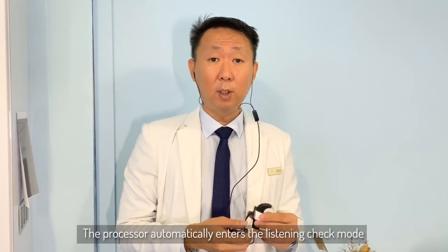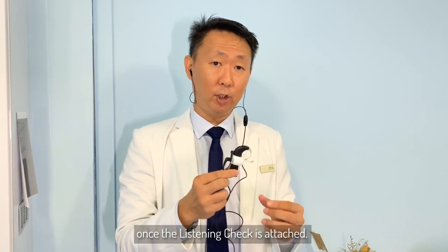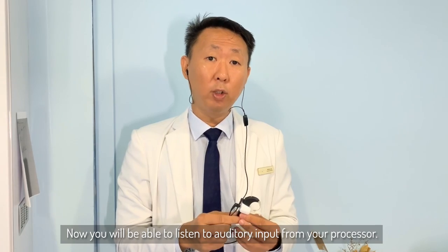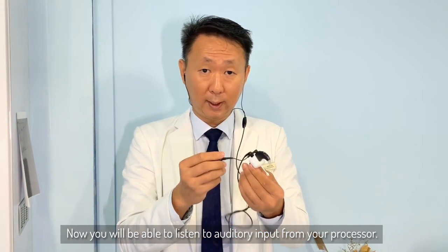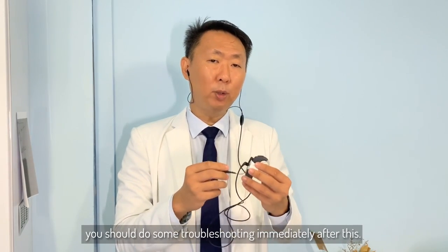The processor automatically enters the listening check mode once the listening check is attached. From now, you'll be able to hear auditory input from your processor. Now if you find the sound still intermittent, then we should be doing some troubleshooting immediately after this.